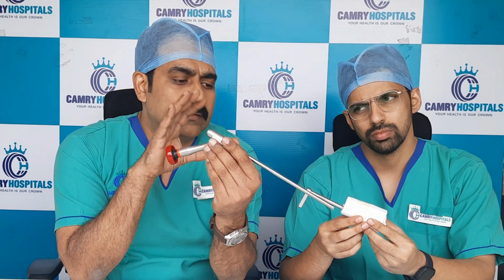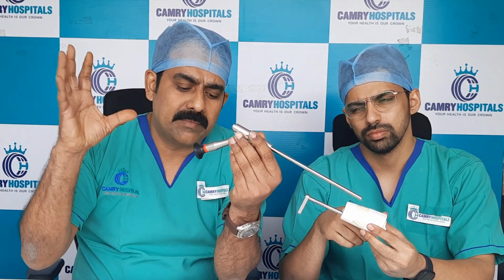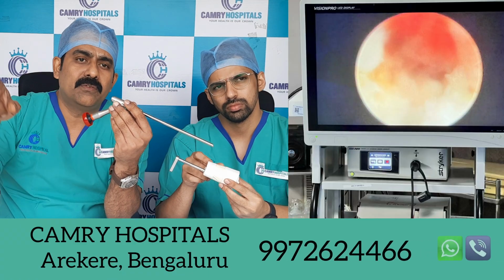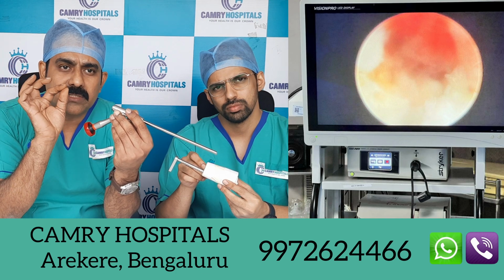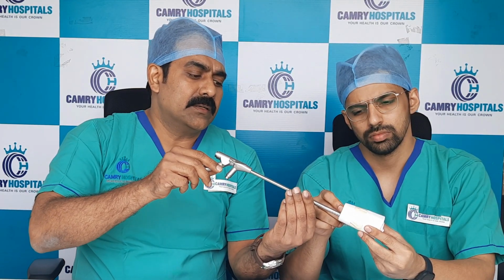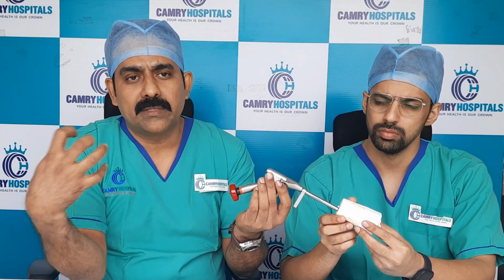Once this scope is inside, this is called the PELD endoscope. Then we will connect this end to the magnifying camera, which we view on a 4K display. So we get a magnification of around 60 times on the tissues. Once we confirm the channel, we go in with the tube inside. This is the working portal and always this will be held. Then we connect the scope to the camera.